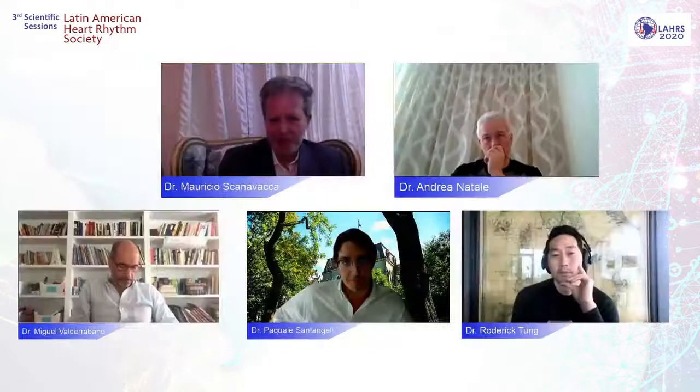And how to apply energy, of course, we always try with unipolar first to the shortest PPI, the best that we have in the area of early breakthrough. We go to the other side, like we do for VT ablation occasionally, and rarely you have to be prepared for something more, including bipolar ablation. That's it. Great, thank you.